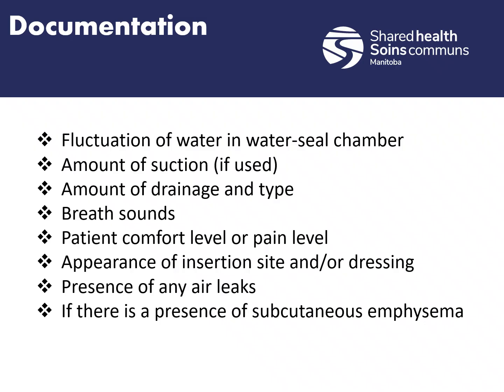And of course, if there is presence of subcutaneous emphysema. So we've got all that bubbling, and then when we check the site, there was subcutaneous emphysema. That's kind of a big red flag there. So we want to make sure we're documenting that and telling the receiving facility.